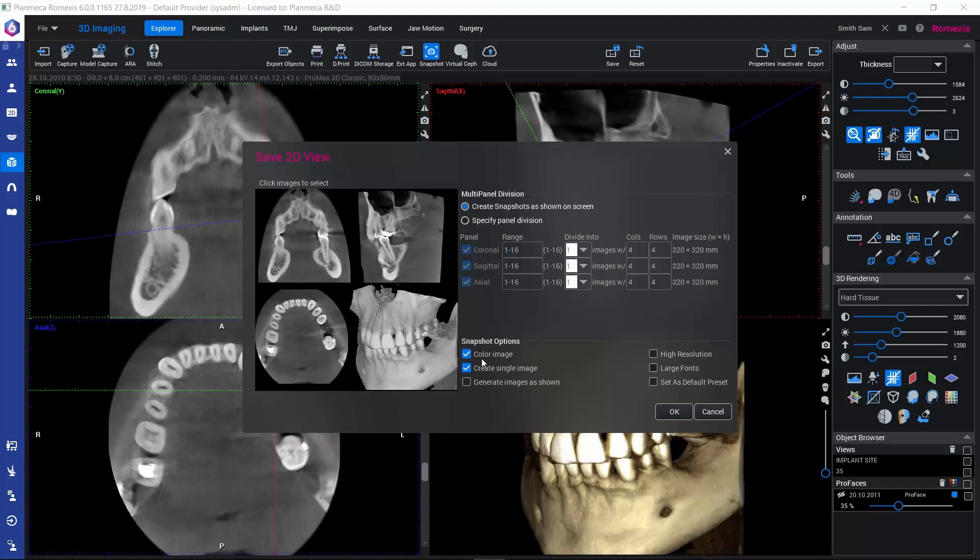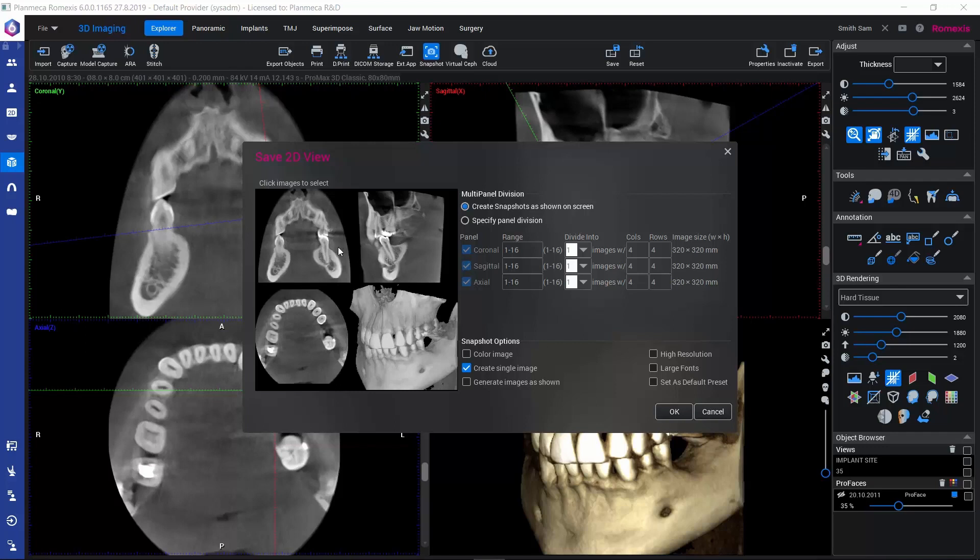Now a little bit about the options. If we select Color Image, the image is saved as an 8-bit colored image. If we deselect that, it will be saved as a 12-bit grayscale image. Especially if we would like to work on these 2D snapshots later in the 2D module, it might be better to save it in black and white.